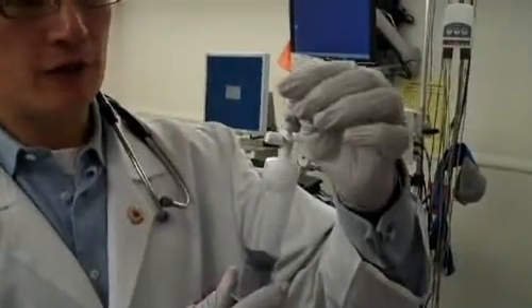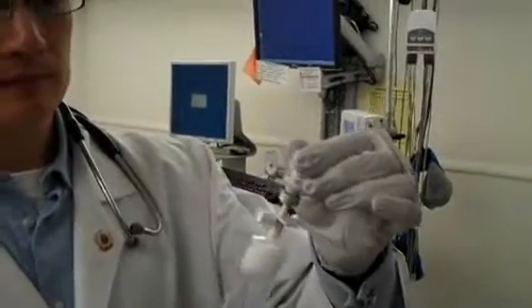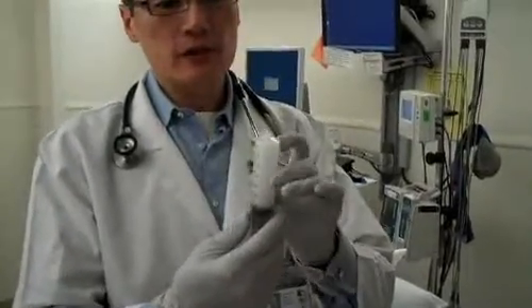I take the Definity and withdraw the contents of the vial into my saline, and I just gently mix the solution. I usually leave a little air bubble in the syringe, and I can use that to resuspend the solution if I need to during the infusion of the contrast for the study.